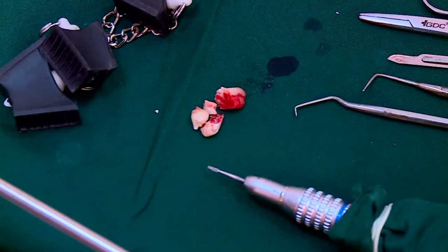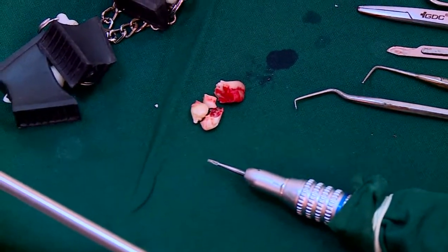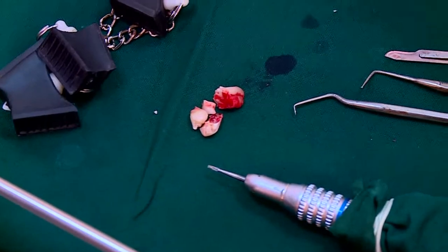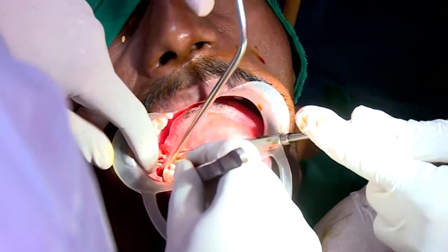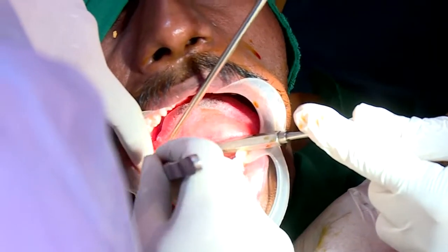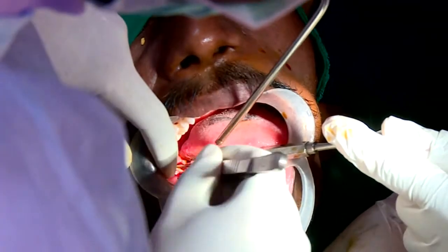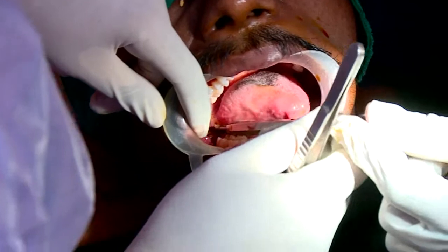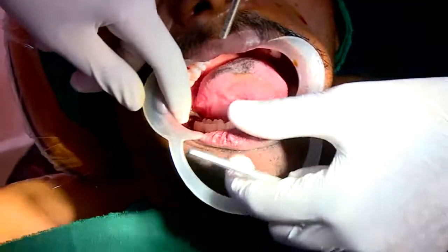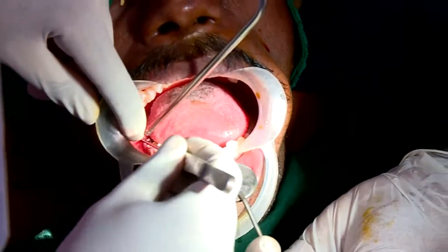After this, there is going to be suturing. It will be a quick suture. Okay, it is a non-absorbable suture. Always we have to try to give tension-free closure. Only then the wound margin won't break down again, or any wound dehiscence won't happen. Suturing also prevents the clot from being dislodged, and prevents complications like dry socket.